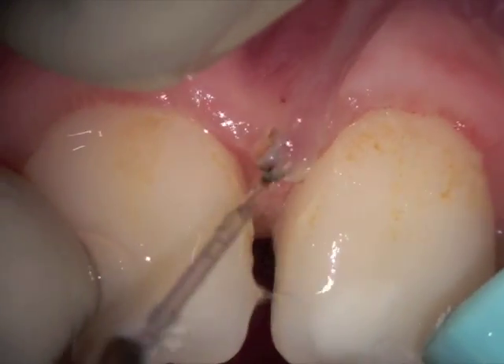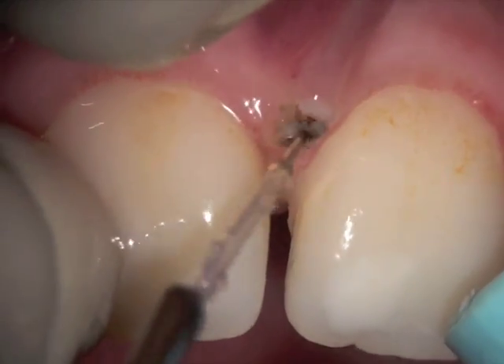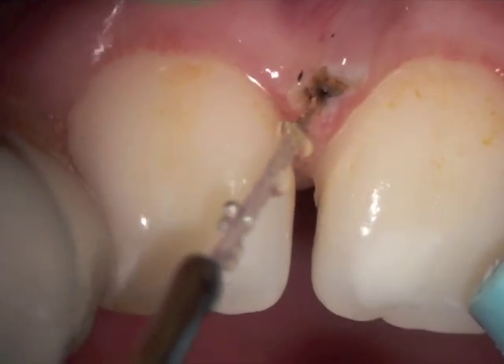We're lifting up the attachment, pulling the upper lip with our left hand and cutting with our right. As you can see, we're slowly creating an initial cut that will actually eventually become diamond-shaped.